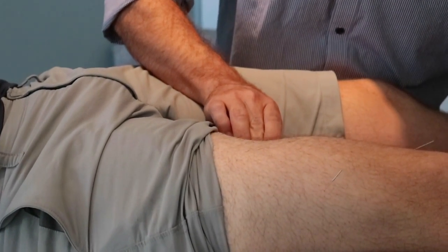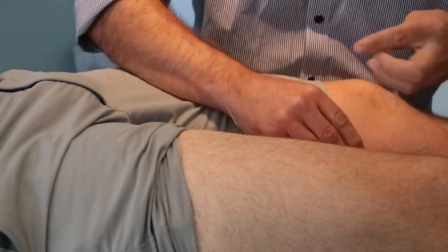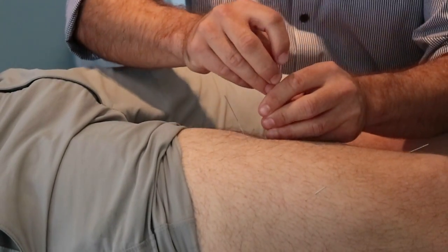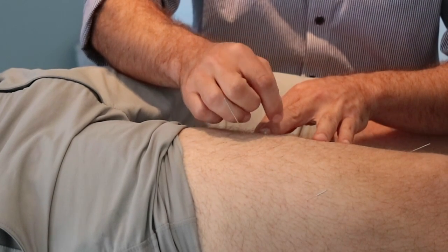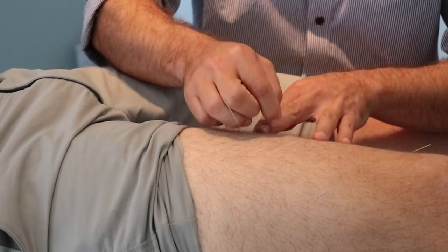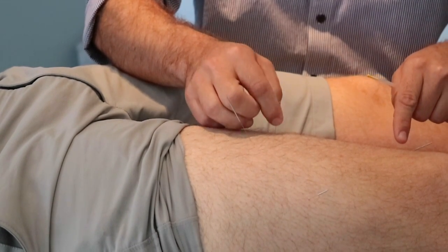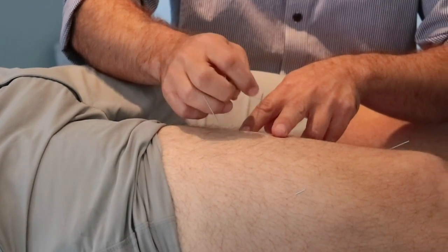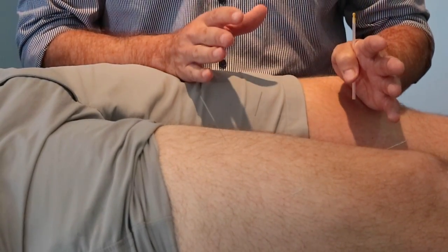Feel a bit of ropiness there, and he feels a lot more through that region. And then there we go. So we're now onto the VM. It's a lot thicker needle. Even gumpy hands like me can get this, and we've had a huge amount of twitching. Now I'm getting the twitching down at the VM as well. The VM's jumping around. So that is the needling of the quadriceps.